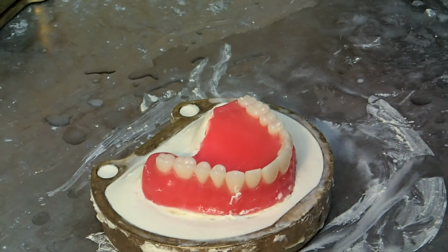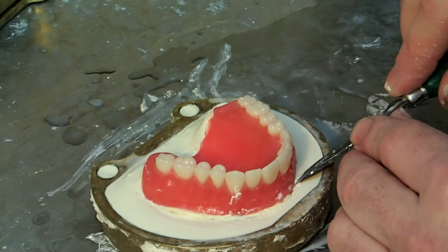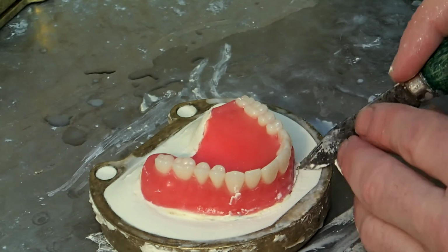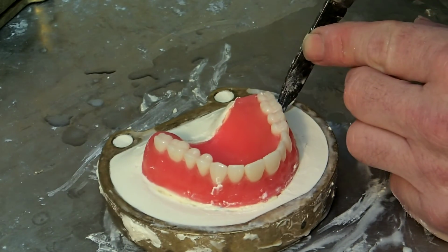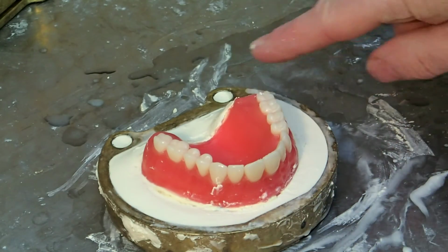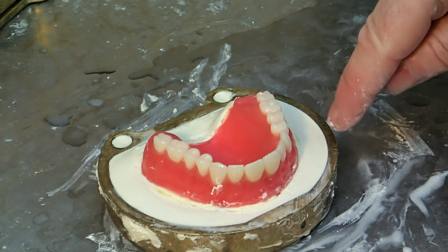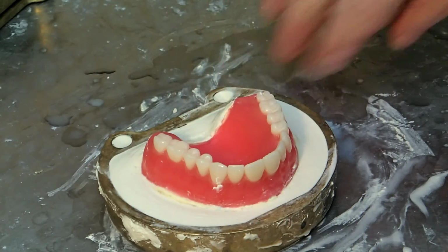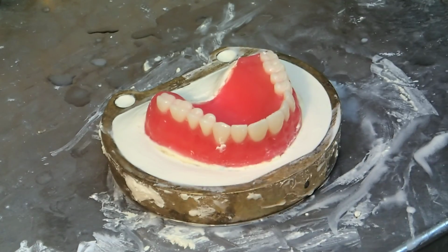The stone also comes to the land area of my model. So this model's got a fairly thin land area, so it's hard to see there. But I've sunk the model in. Just trying to define it a little more for you. I've sunk the model until the land area of the model is level with the top of the flask, or with the edge of the flask. So I've got flask, stone, land area all at the same level. And I just have to let this finish setting, and then I can clean it off with a little more water. The stone around the flask will just clean off by putting a little water on this, and my first stage of flasking is done.